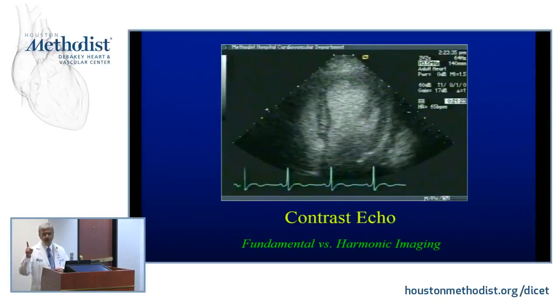Mechanical index is crucial. Otherwise, you're going to destroy a lot of things. And the destruction is going to look almost like a hurricane heart. It will be grainy throughout, grainy in the atrium, grainy in the ventricle. So a high mechanical index will give you a different vision, where you get into trouble optimizing the image.